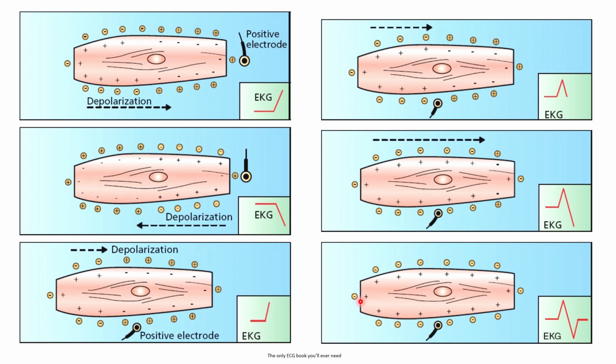And now let's talk a bit about the conduction system again, and then we will move to the ECG components. There's something that I want everyone to keep in mind. In the case of depolarization, for example, let me bring the pen, we have the electrode here. By the way, there was something that we have to differentiate between them. I guess I even confused it in the beginning. I forgot to tell that.